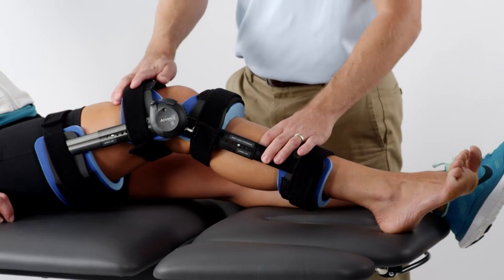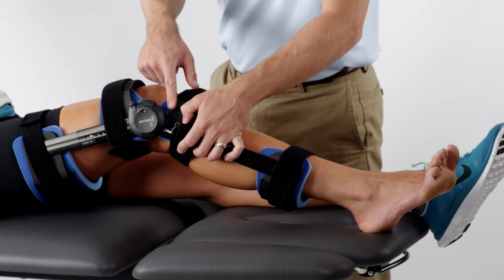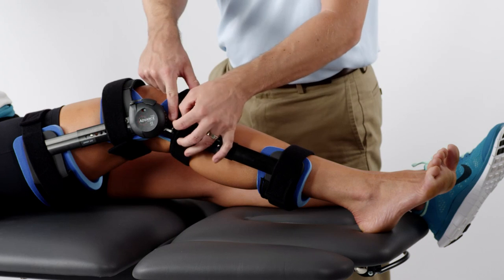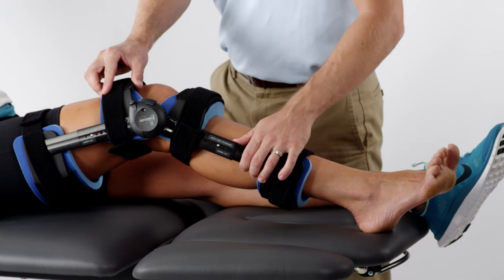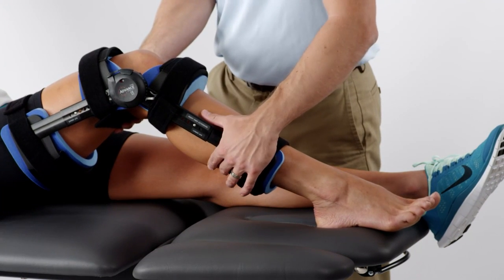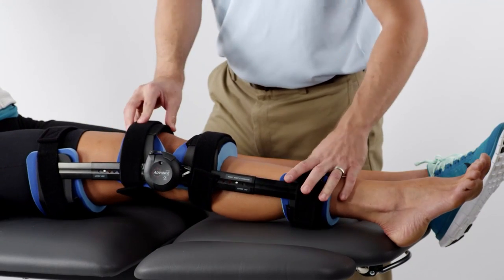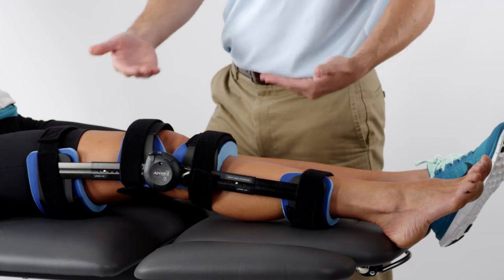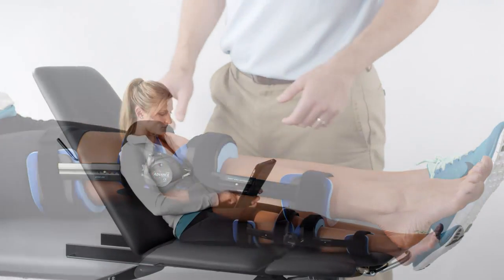With the straps secure, your next step is to place the device into dynamic mode. First, disengage the lock lever safety by swinging it away from the lock lever. Then apply a slight force on the strut to disengage the lock lever. The advanced orthosis now provides a dynamic stress on the knee.